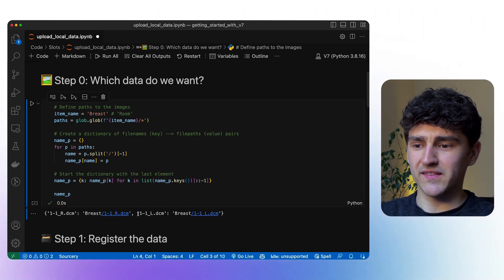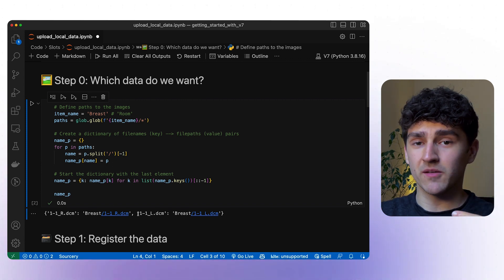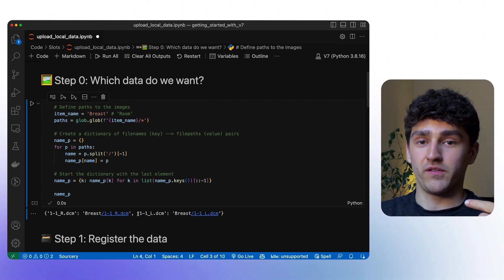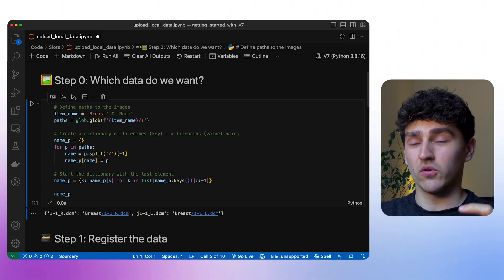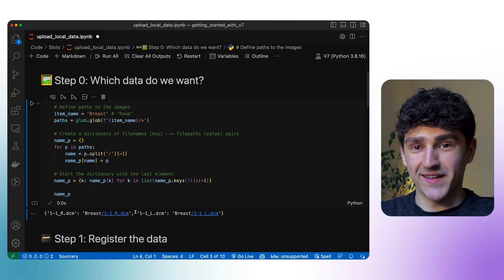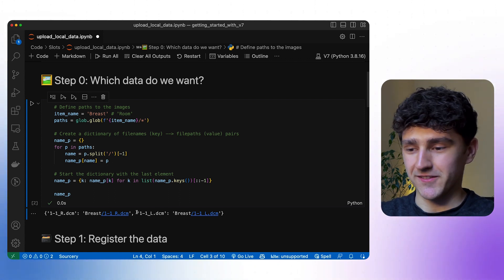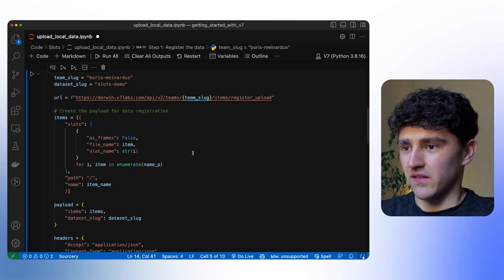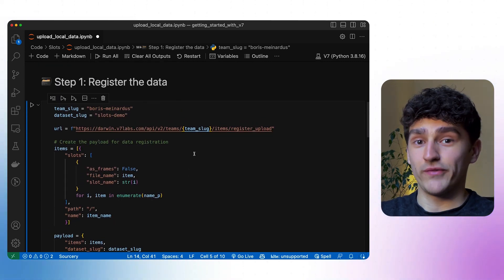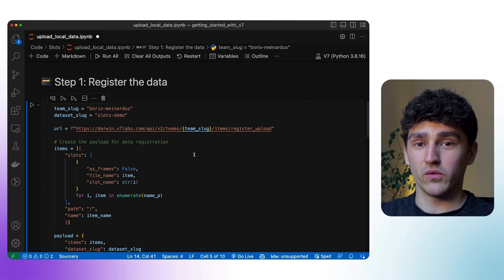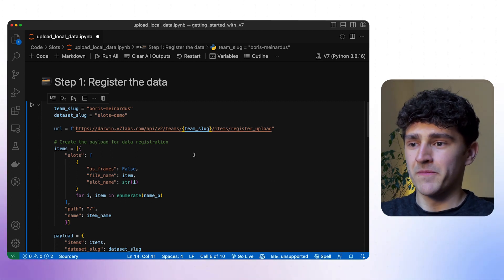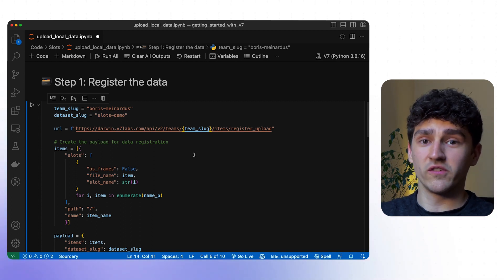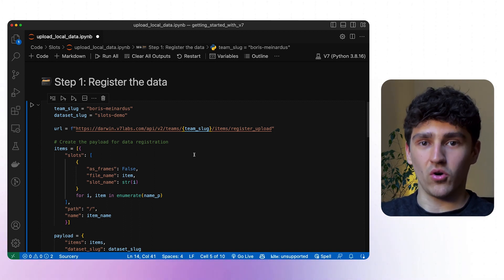This is handy for looping over the individual items, which we need to do to upload the data — we have to upload every single item separately. Step 1 is to actually register the data. We have to register each single file to V7 so that V7 knows how many files we are going to upload and what they are called.